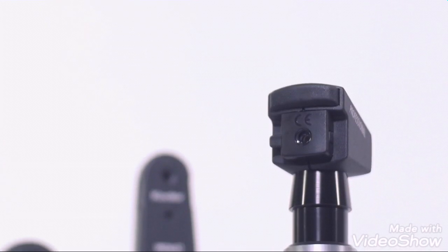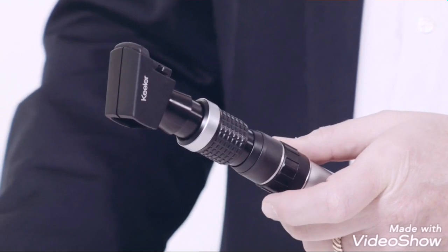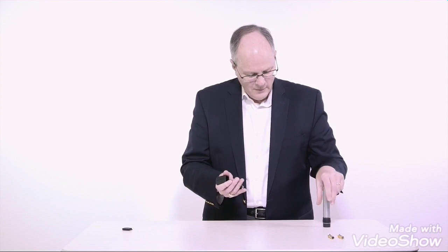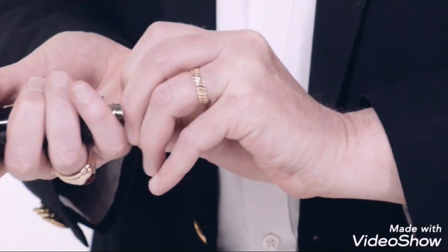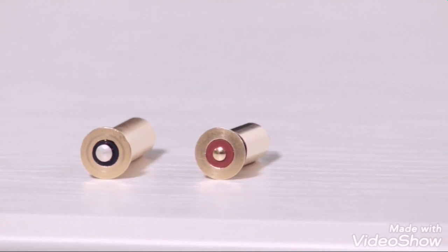Moving on to our handheld retinoscope — turn it on here. The Keillor retinoscope is a true bimodal instrument optimized for outstanding performance with either a streak or spot mode. In addition, the exclusive streak LED BCS technology offers increased brightness, contrast, and sharpness.